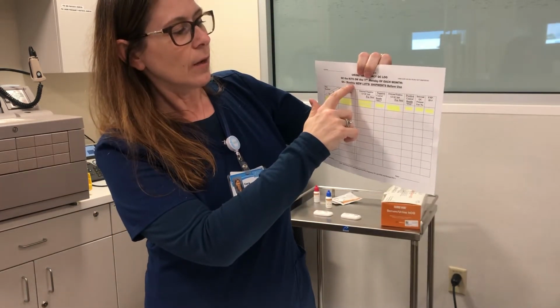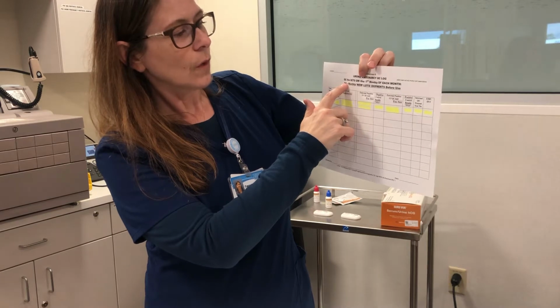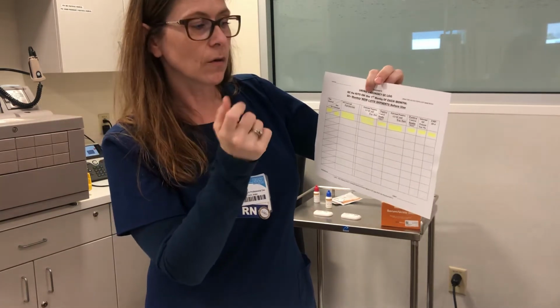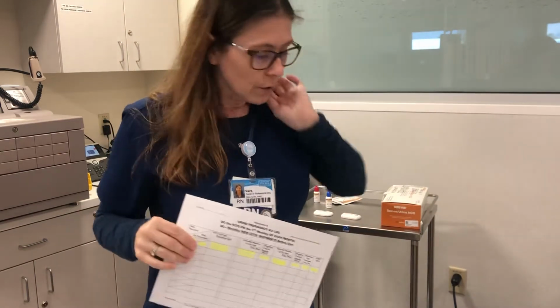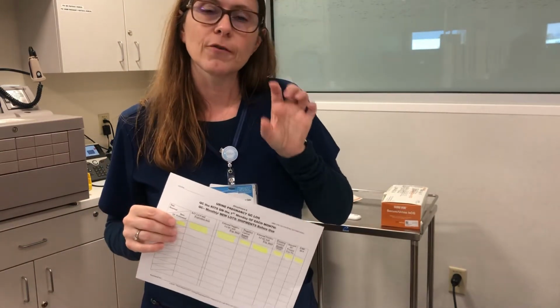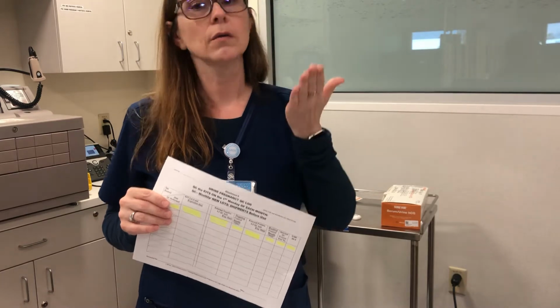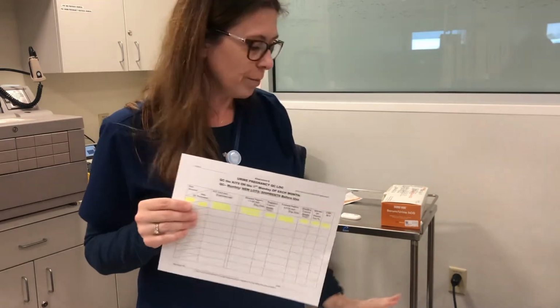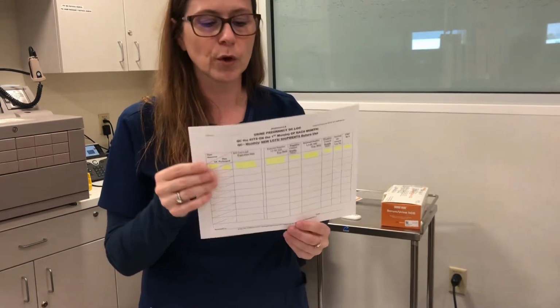And then also you're going to QC any new shipments or new lots. Now, they do have a new lot for QC coming out, probably next month will be our first time using it. Right now we're still using the old lot, so that's fine. It won't be a change in the AccuCheck when we go to enter it.